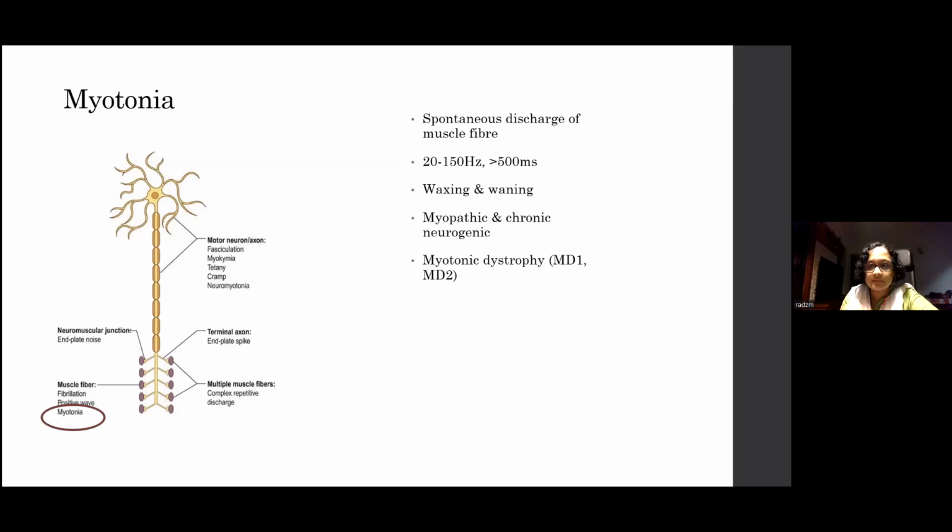Something quite interesting: in myotonic dystrophy type 1, the most common one, you'll see the myotonia everywhere, but distal more prominent than the proximal muscles. In myotonic dystrophy 2 or proximal myotonia, you see it quite proximally, like trapezius, for example, and in paraspinals and deltoid much more commonly. And interestingly, the myotonic discharge that you record is slightly different. It has more of a waning quality in myotonic dystrophy type 2. So it goes like a... while myotonic dystrophy 1 goes like so. There's a slight difference.